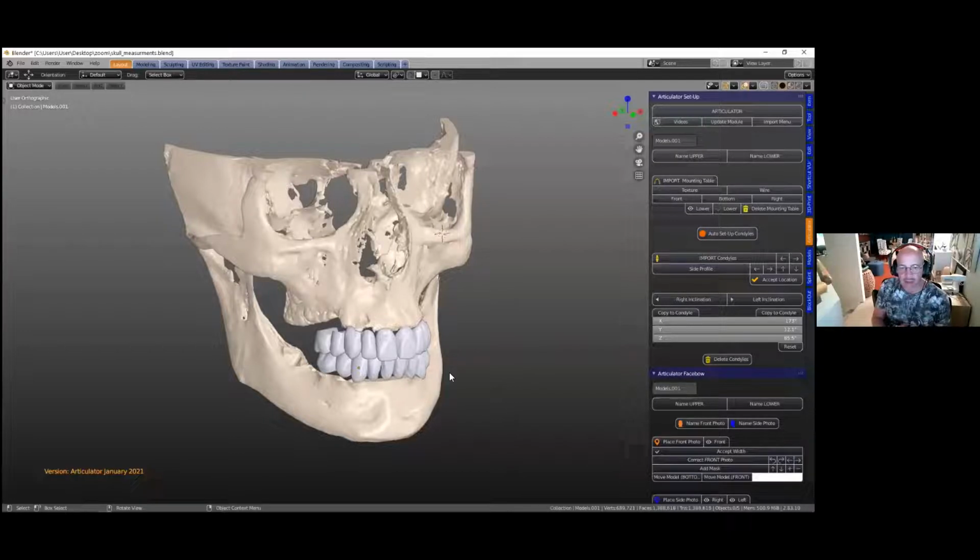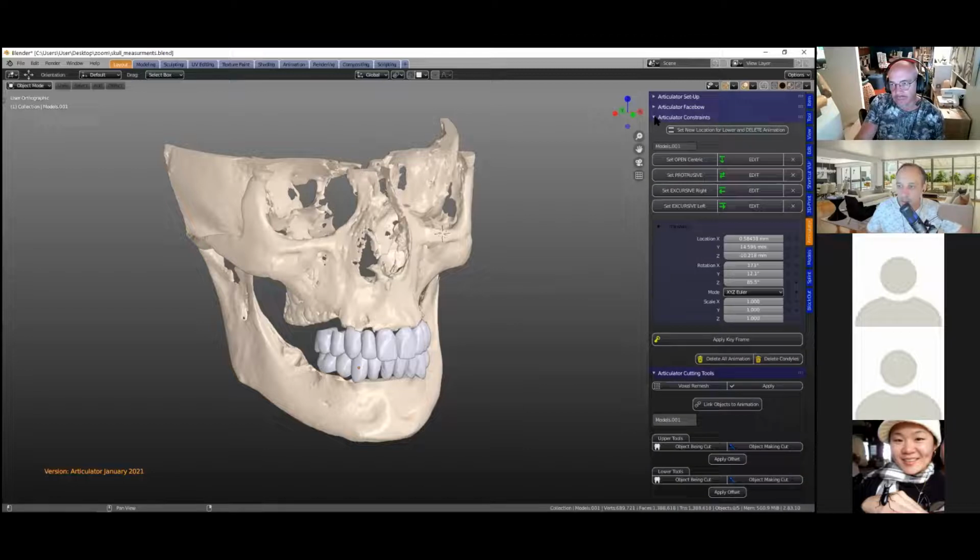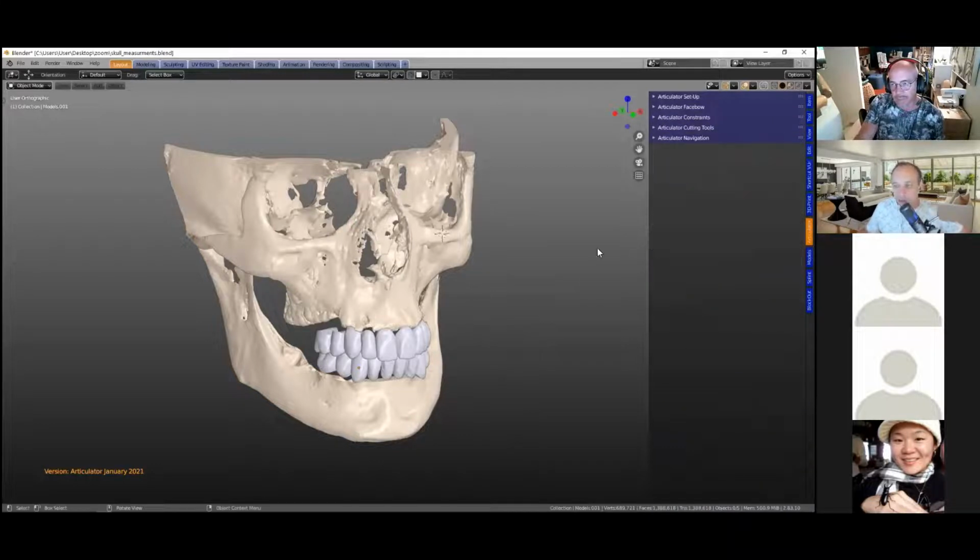So I've done a lot of coding and so on in the background, and Wolfgang's changed the videos to the Facebow and the articulator. Yeah, it's only the Facebow part. The actual majority of the articulator remains the same. So from constraints on, it's all exactly the same, except Michael's done a bit of coding work there, a few fail-safes, which is great. But yeah, it's mainly the Facebow.